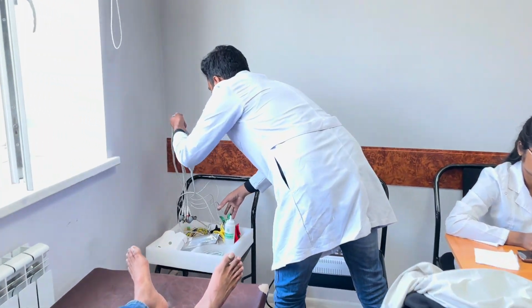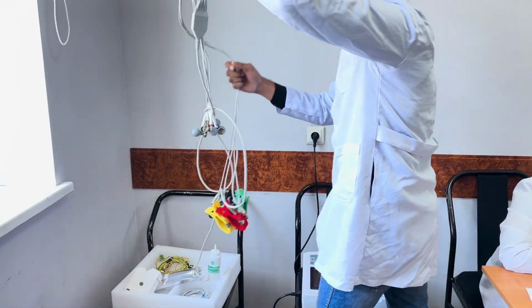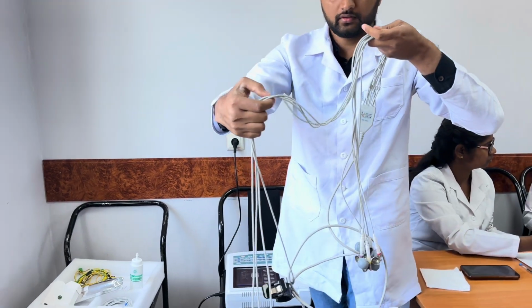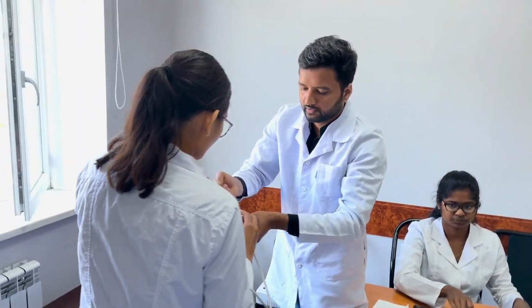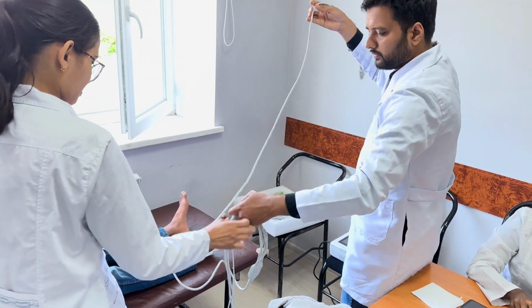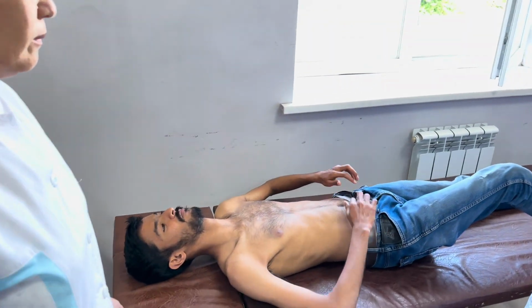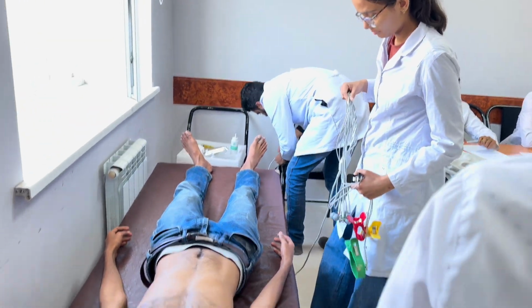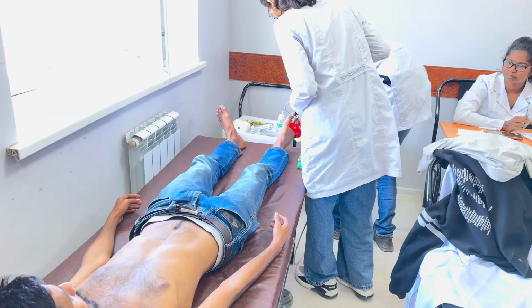We make the attachment of the leg. Now, Rupesh, please help also with preparing the patient, as an assistant. Lie in position. Connect the apparatus. We must connect the ECG apparatus. Check the ECG functions.